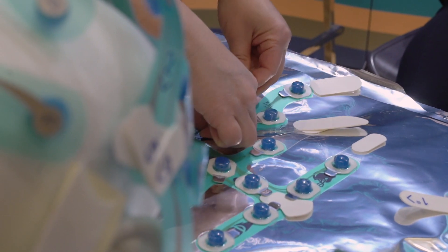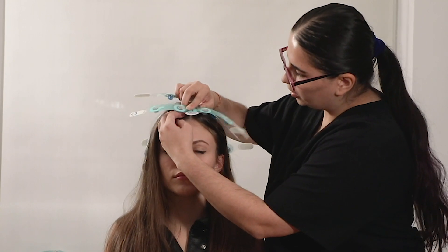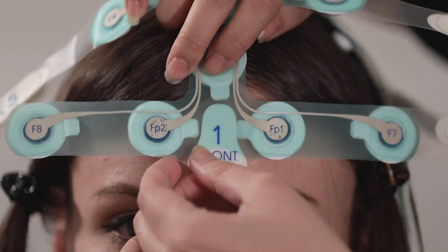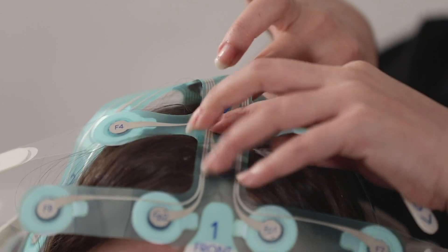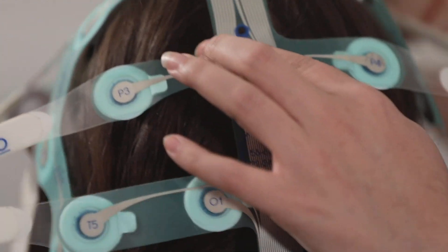Place the front nasion area: peel off the adhesive cover from the nasion area at the front of the forehead, marked number one, and adhere it to the center of the forehead just above the eyebrows. Bring the center strip electrodes of NeuroCap flush towards the back of the head, placing down firmly along the scalp each electrode one by one.